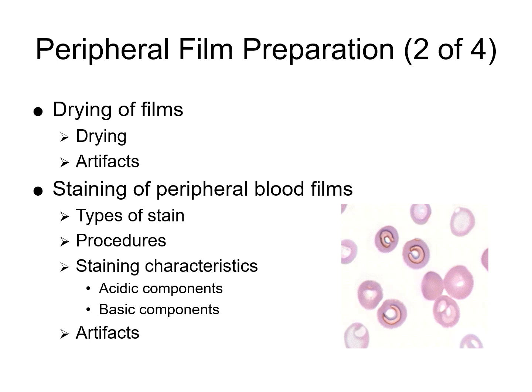The exact staining times and buffers could differ depending on which kit you're using. So just make sure you look at those and you know exactly what you're doing, because if you have the wrong time or the wrong buffer pH, it could affect staining quality.